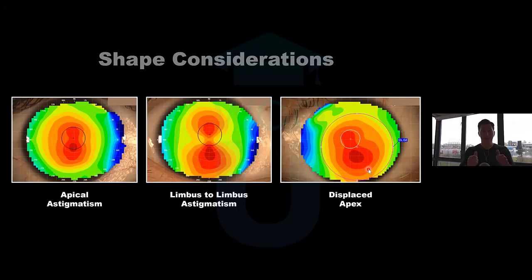In other words, we kind of target having the treatment really well onto the center of the pupil and the visual axis. And that's always provided the least aberrations, the best quality of vision to Ortho-K patients. But recent research has shown us that the smaller the treatment zone and the more it decenters, the better the myopia control.